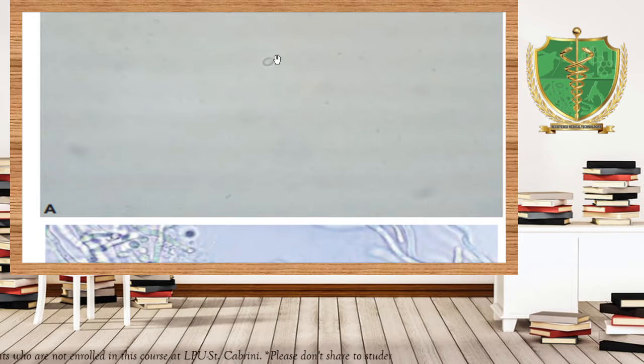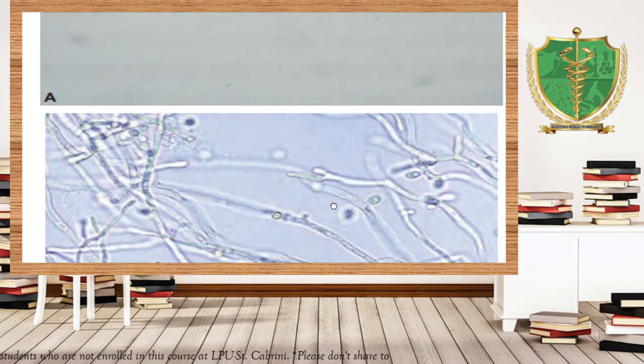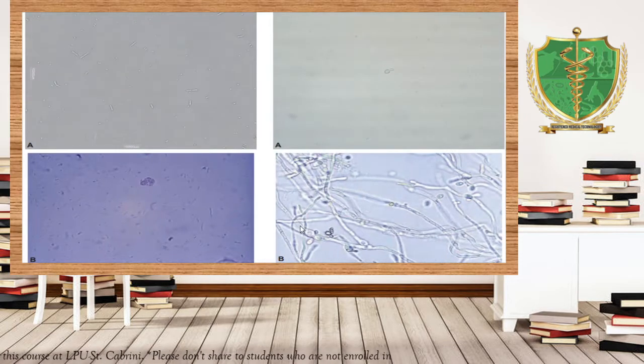As you will observe, kung wala po itong portion na to, that could be mistaken as RBC. But since we have this one, okay, this one, no, the buds, that is considered your yeast. That will give us a clue that it is a yeast. And this one, filamentous structures, no, these filamentous structures are what we call the mycelial structures that can be seen in the urine.